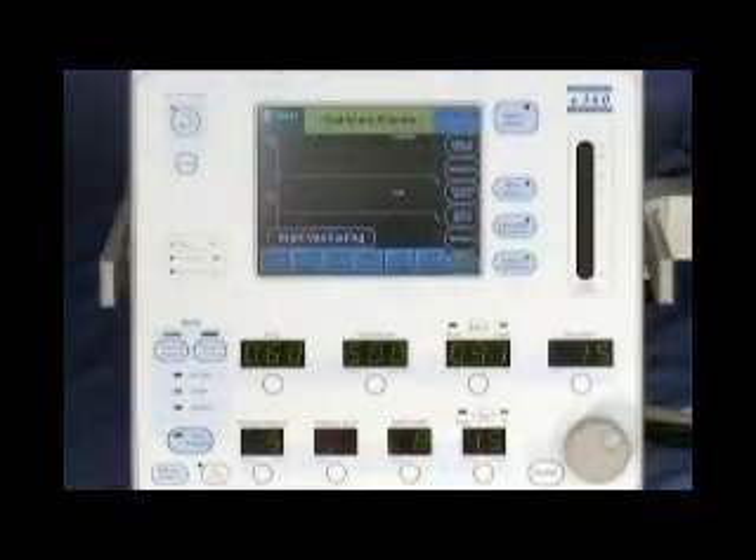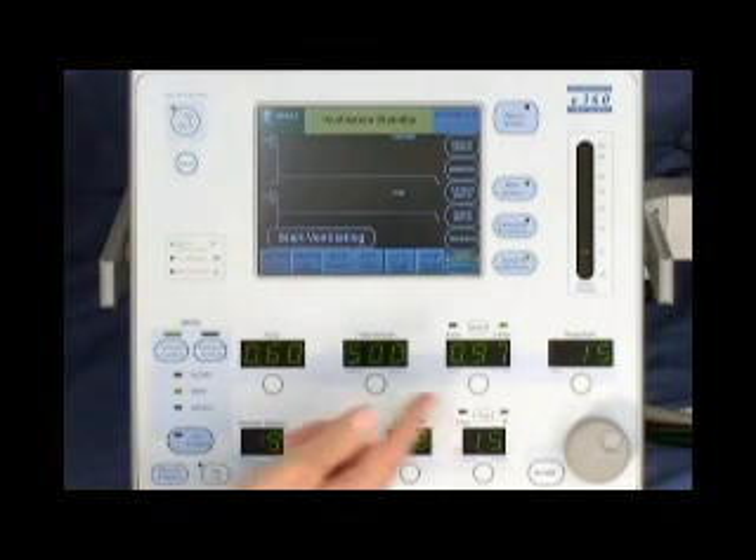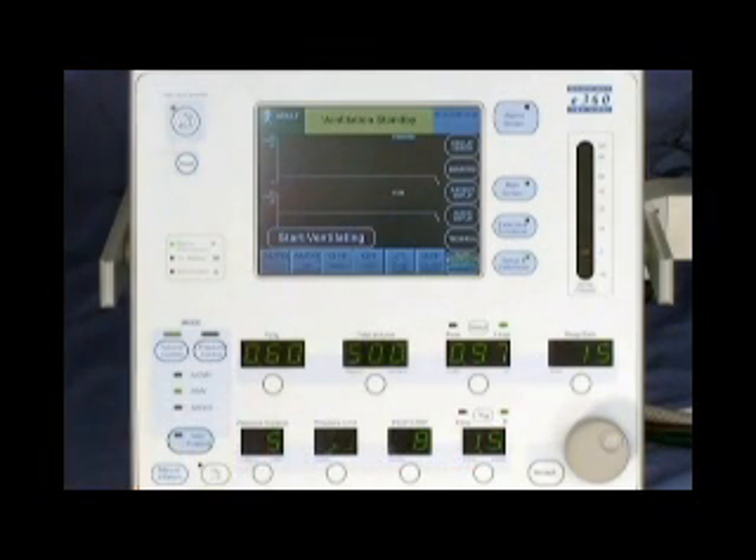All essential elements of the E360 Ventilator System are in one unit with a combination control panel and color graphical user interface, or GUI. The ventilator is very easy to use and quick to set up. All primary control settings are visible at a quick glance. The touch-turn-accept method or touch-toggle-accept methods are used to adjust all ventilation and alarm settings.